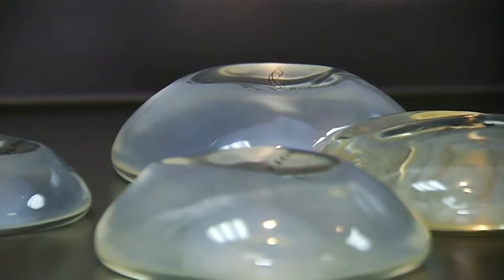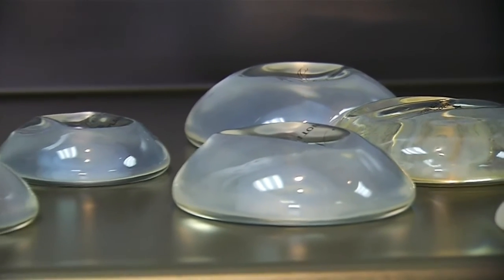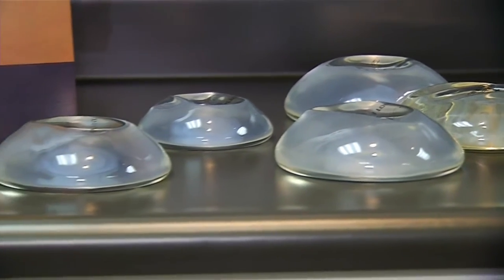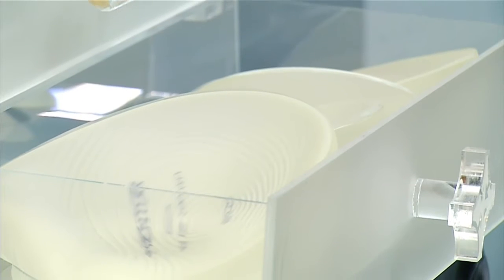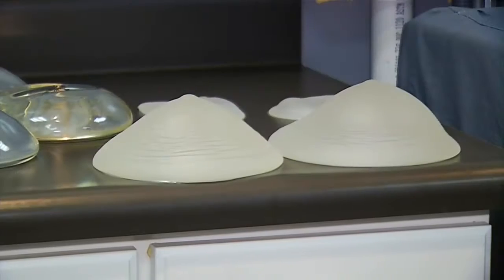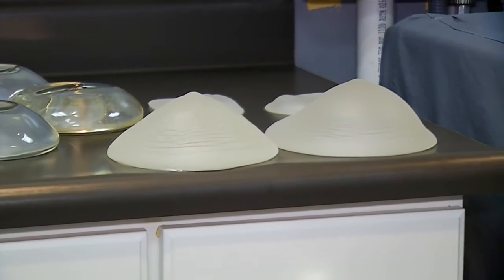And how do you know what to use? They have sizers nowadays that facilitate that. In the past, we used to just put the sample implants in there and see how it looks, and then go from size to size. So let me just show you.